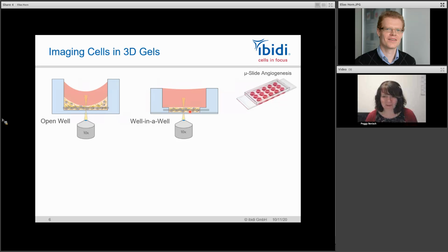Thank you. Tatjana asks, we talked about collagen matrix, and can you recommend any other attachment factors? The collagen itself is only collagen. Yeah, this is true. If you want to increase the attachment inside the collagen matrix, you can easily add other collagens, not only collagen type 1, but also collagen type 4, for example.